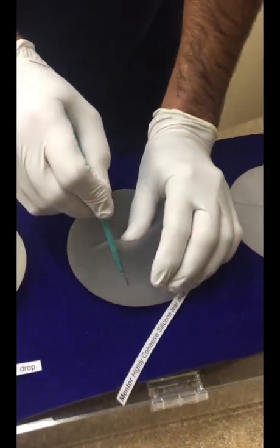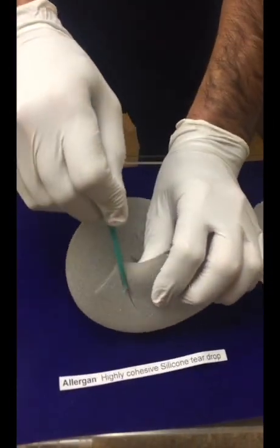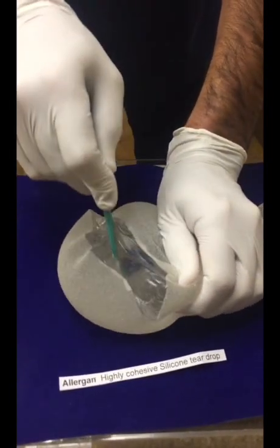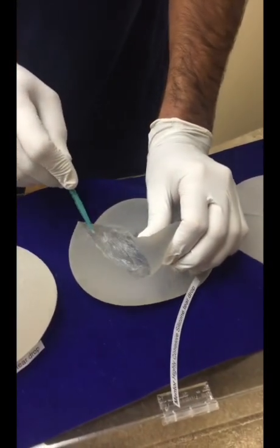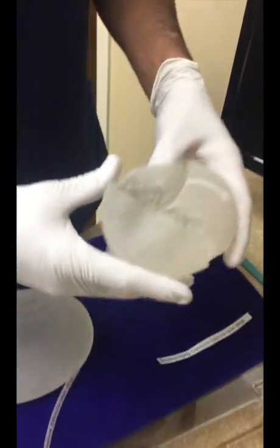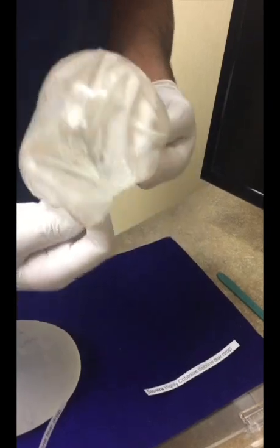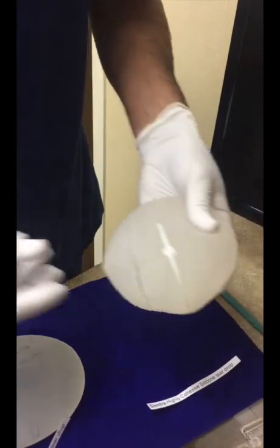Here's a Mentor implant — going to do the same thing. Here's all three of them. We've got a big old cut through the silicone and into the material. Now here's the Sientra implant — just take the shell almost off if we can. And there's the material.